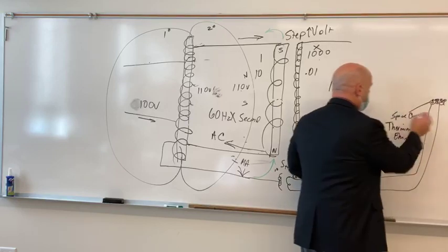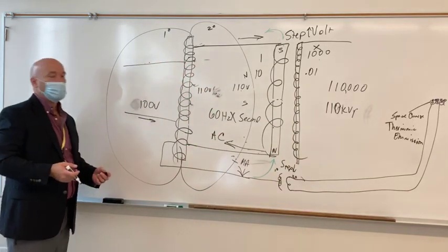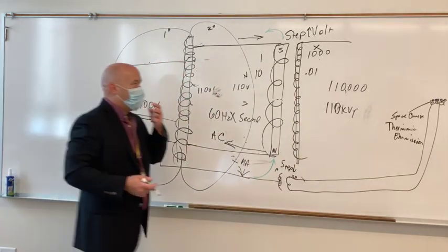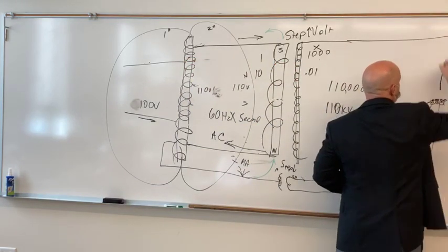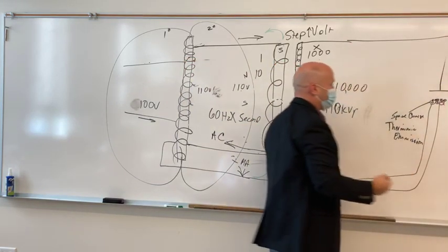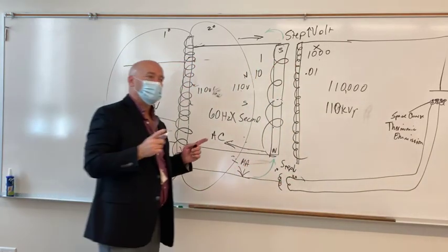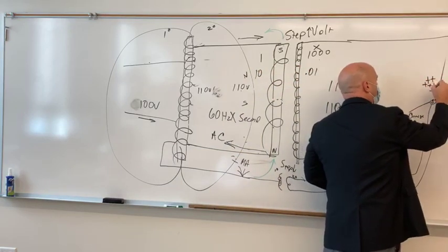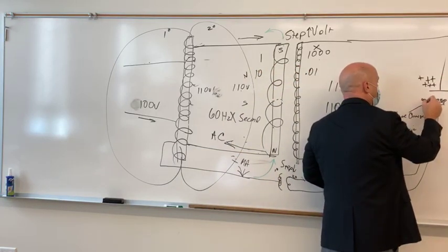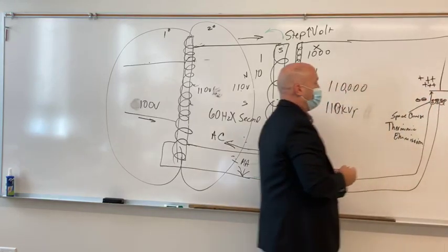All right? So we've created a space charge, a collection of electrons on the filament, in anticipation of making an exposure. Now when we push the exposure switch, at the same time we'll get rotation of the anode. So that's all happening during the prep stage. The only thing that happens during the exposure stage is this becomes relatively much more positive and this becomes much more negative. And we'll make our exposure, these things jump across the tube.